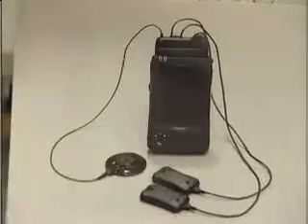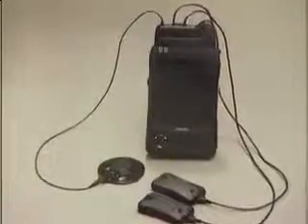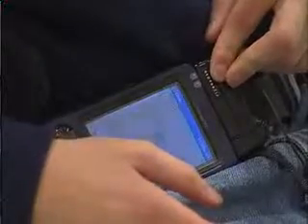Jeremy's nerves. They were then hooked to a Casio computer, which Jeremy wears on his belt. He tells the computer to send out little shocks to his nerves, and voila! 7 surgeries later, Jeremy can stand and walk.